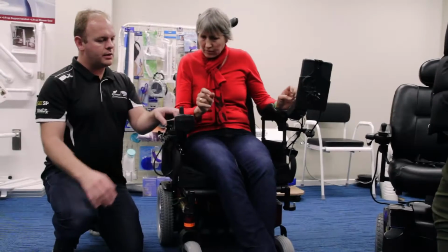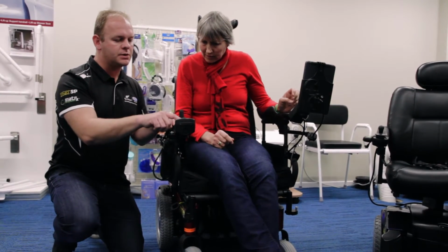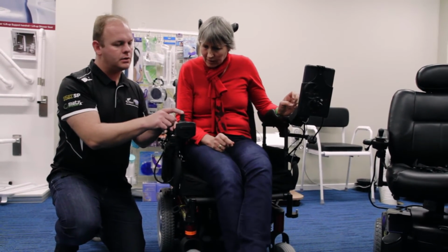Adjusting joystick throw is how far the person needs to be able to move the joystick to get the chair to drive. Typically if you go fully forward, that's full speed, done. You can adjust how far you need to move the controller to get the chair moving at what speed. So this is all programmable. For people who are losing some strength but still have reasonable function, it might be a case of just reprogramming the chair, particularly in the short term, to keep them going.